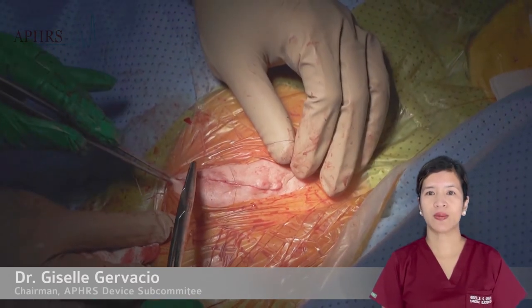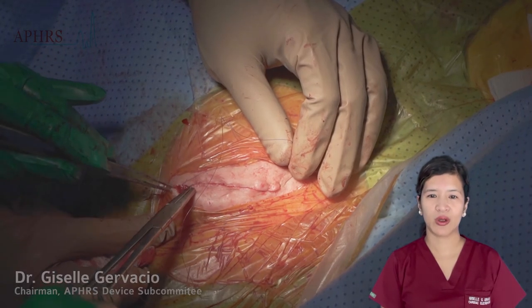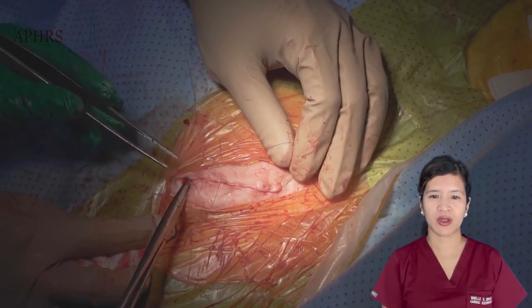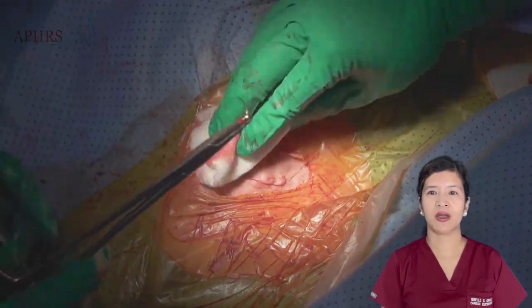A layer of Steri-Strips is finally applied and the wound is covered with Tegaderm with a thin layer of gauze. The wound is kept dry by sealing it with a Tegaderm dressing.